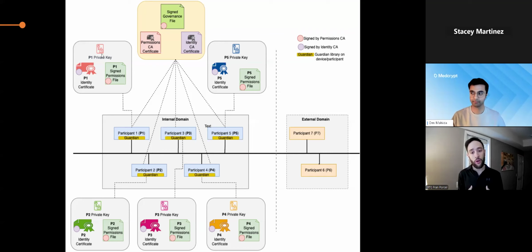Now, when you're developing a system, especially when you're evaluating and trying to figure out what the right technology for you is, whether RTI Connext or socket communication that you build in-house, what do you need to include here? It is normal to check, okay, maybe I can use OpenSSL for this and do everything on my own. So I'm going to generate the keys and the certificates and call the OpenSSL commands myself, which I have done, and it's super tedious because I end up copy-pasting something from somewhere else, which is not even a good practice. But that's the way to do it, because those commands are really long and the output is really hard to understand too.